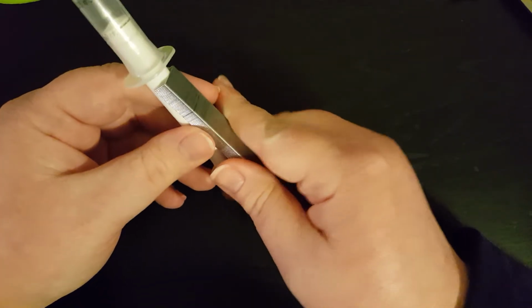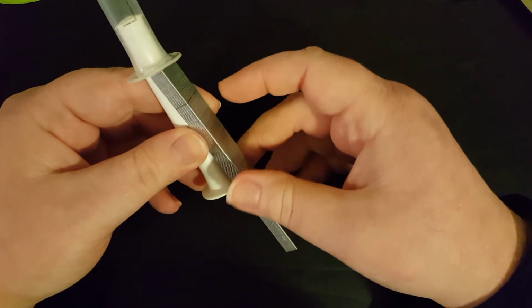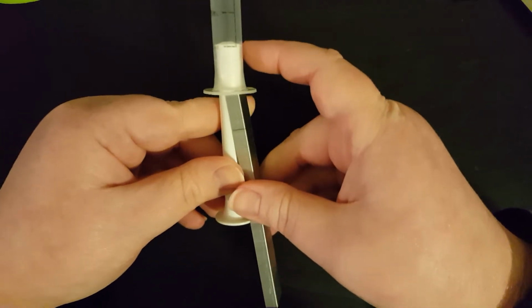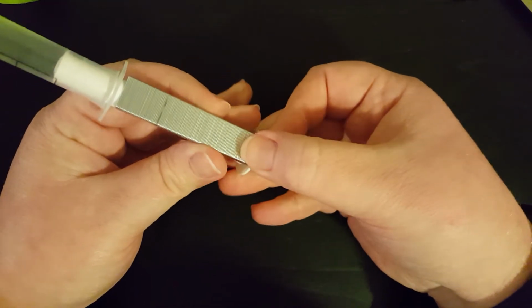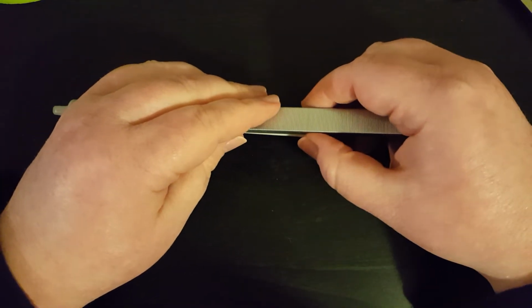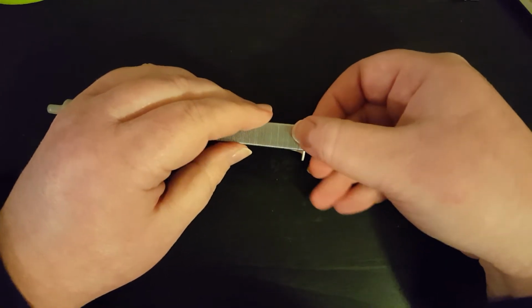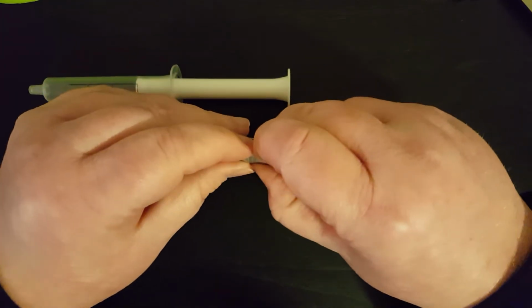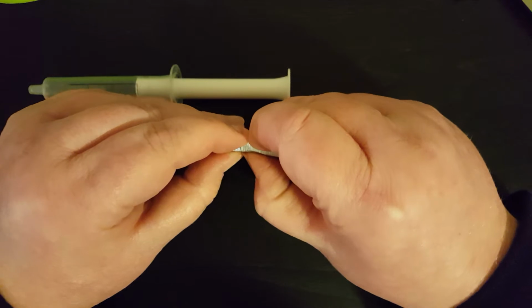Then you place your staples in between the back of the barrel and the back of the plunger, in that gap that you have after you have that measurement. Now, the tricky thing about this is breaking, because you're going to break your staples so they'll fit nice and snug on the plunger. This is difficult because staples don't always break where you want them to. So it may take a few tries, okay? I'm not telling you I went through several sticks of staples, but yeah.